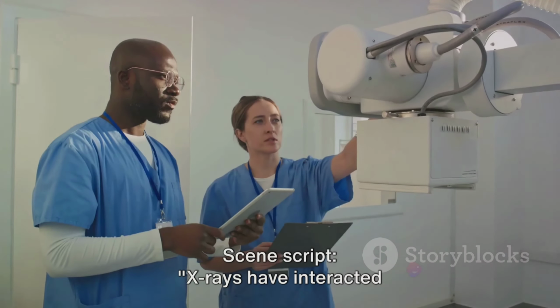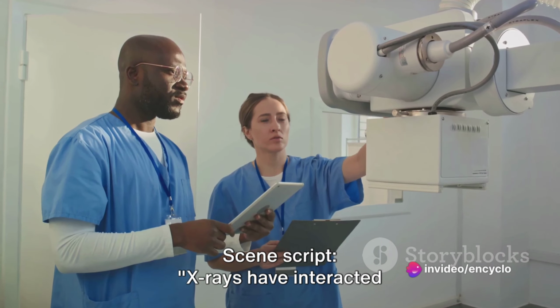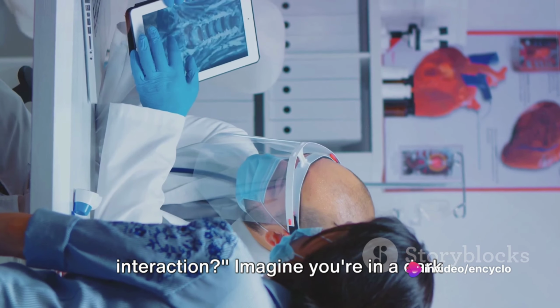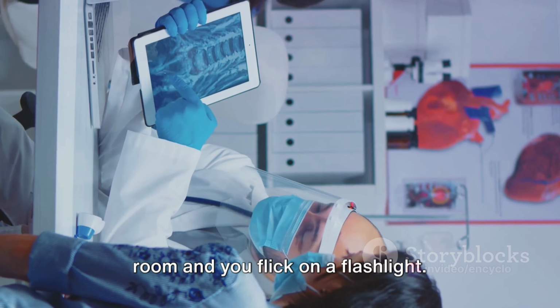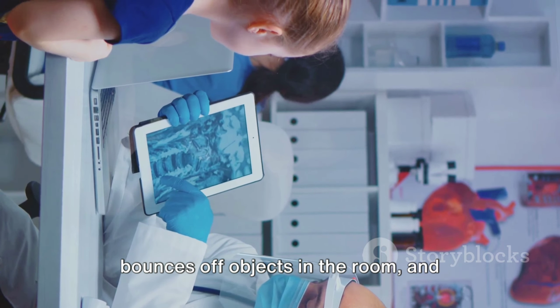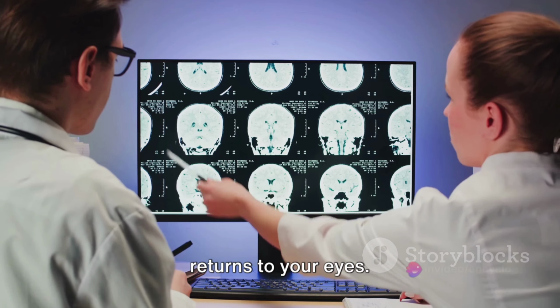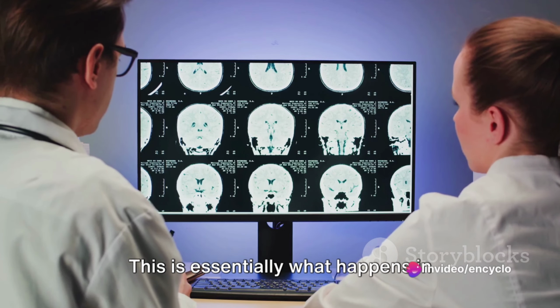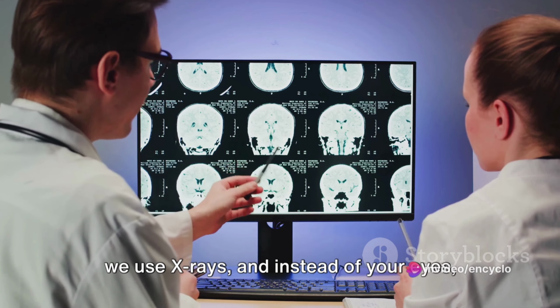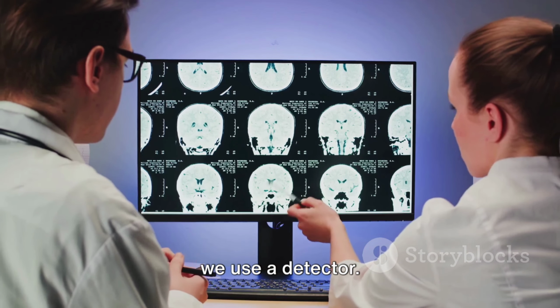Now that we know how X-rays interact with our bodies, let's see how we capture these interactions to get those iconic images. X-rays have interacted with the body, but how do we capture this interaction? Imagine you're in a dark room and you flick on a flashlight. The light travels from the flashlight, bounces off objects in the room, and returns to your eyes. This is essentially what happens in radiography, but instead of visible light, we use X-rays. And instead of your eyes, we use a detector.